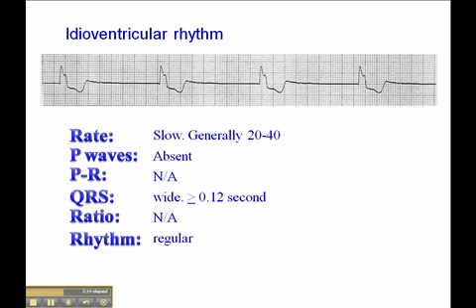Let's just look at what the heart rate is here exactly. Here we find a QRS that falls on the dark line. So the heart rate here is 300, 150, 100, 75, 60, 50, 43, 37, 33. So it's about 35 beats per minute. That is very slow.